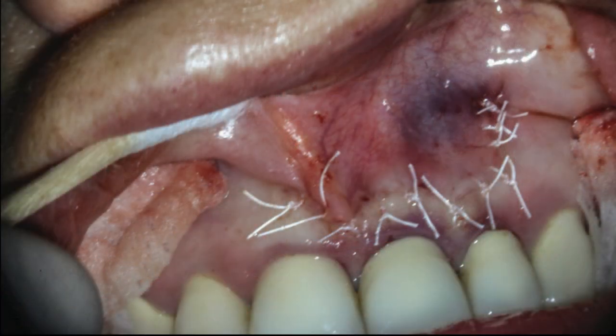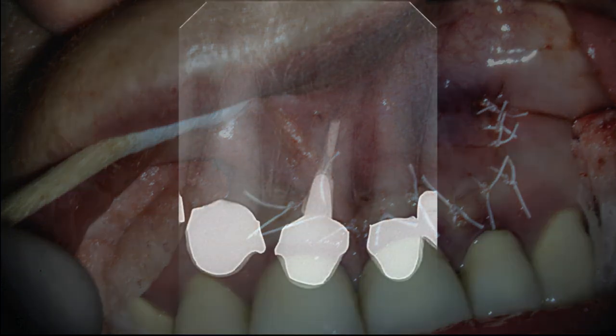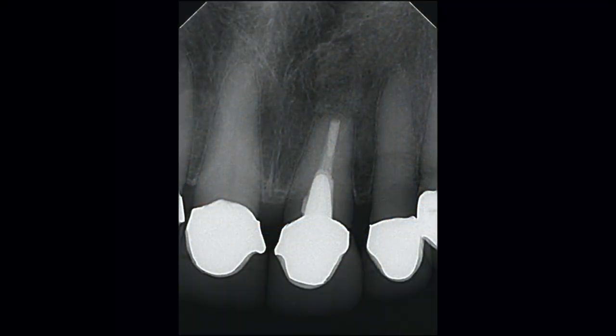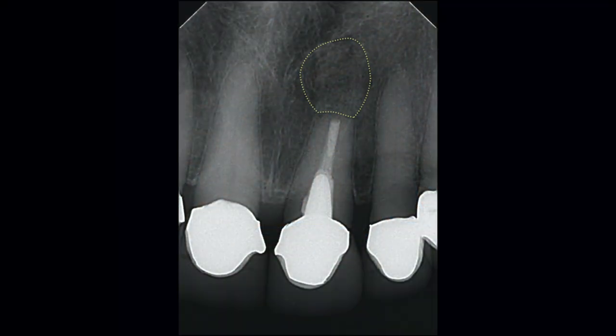The tissue is then repositioned and I was able to close this with just an interrupted suture technique. This is the post-op PA. We can see the graft placement, the resected root, as well as the root end restoration.